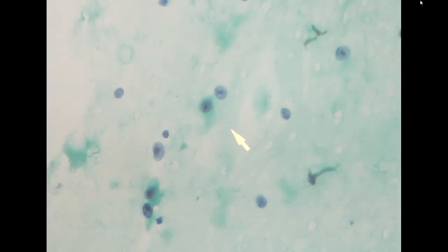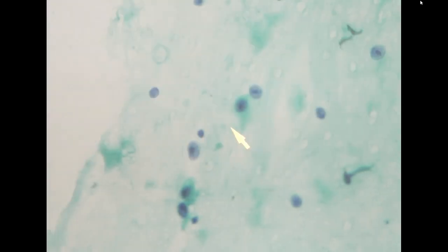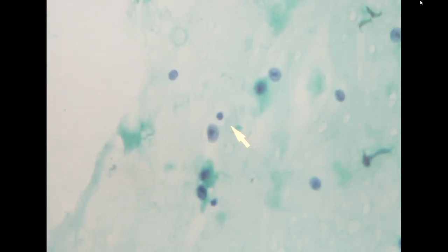In the biopsy specimen, Dr. Zhang received the biopsy and made a very good guess that these are metastatic FH-deficient renal cell carcinoma. The patient doesn't have any imaging study, but she's staining and it is compatible with FH-deficient renal cell carcinoma.